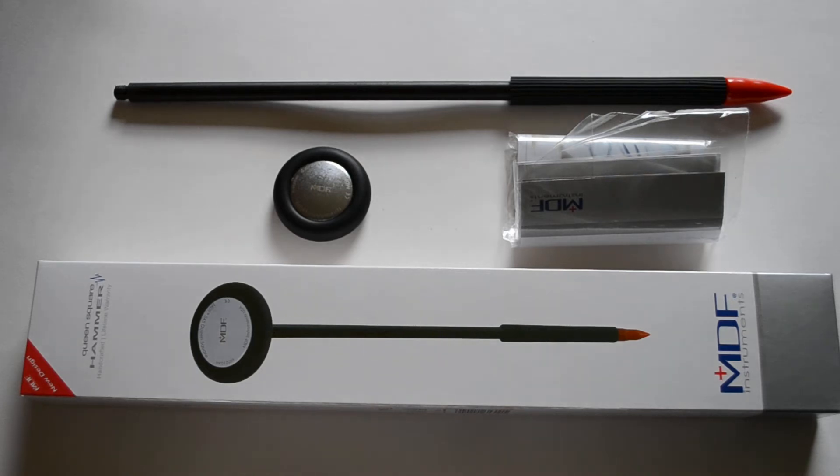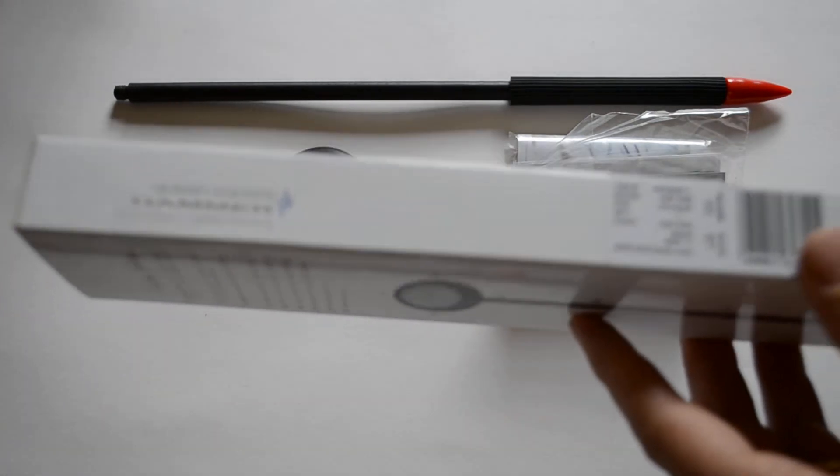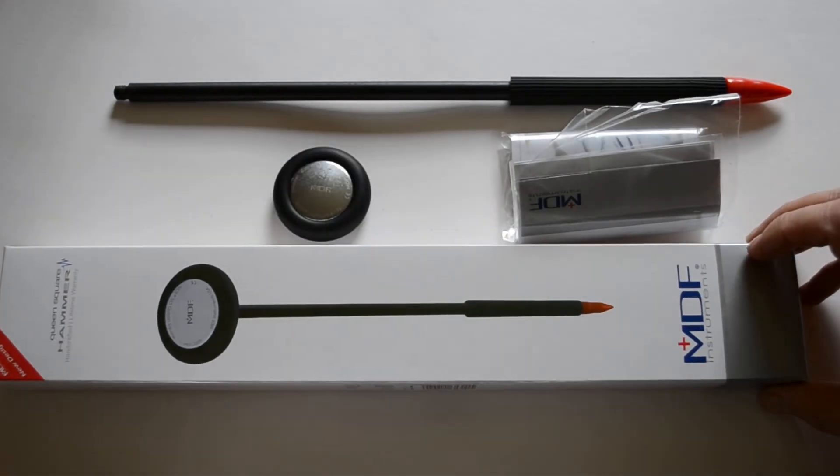Welcome to this video presentation in which we're going to show you the Queen Square Reflex Hammer by MDF. The model number is the MDF 545 — just making sure I get that right before giving you the wrong number.